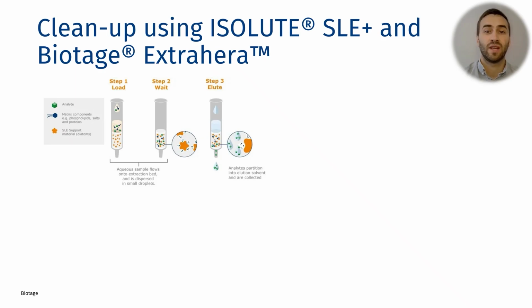We cleaned up using Isolute SLE+, and this was automated on a Biotage Extrahera. SLE is analogous to liquid-liquid extraction, in which the extraction is based upon the partitioning of the DOA and the THC panels from an aqueous sample into a water-immiscible elution solvent.